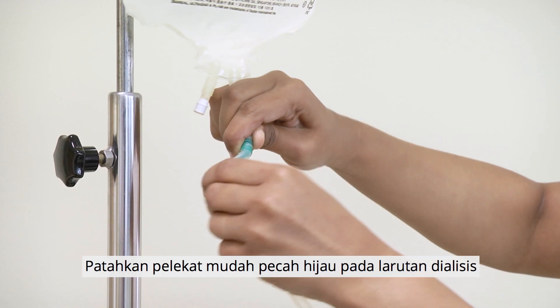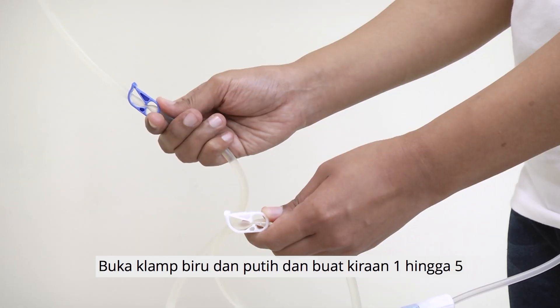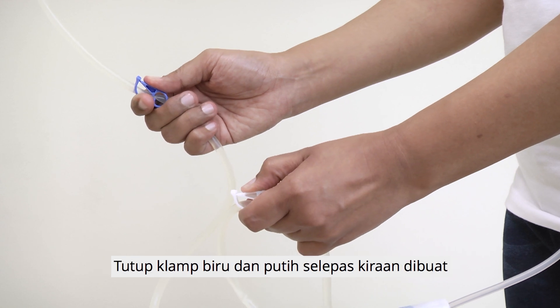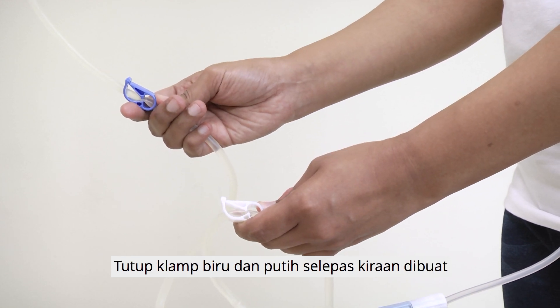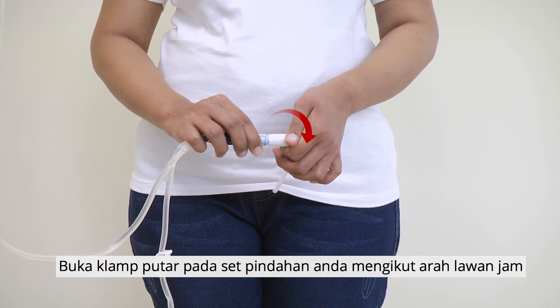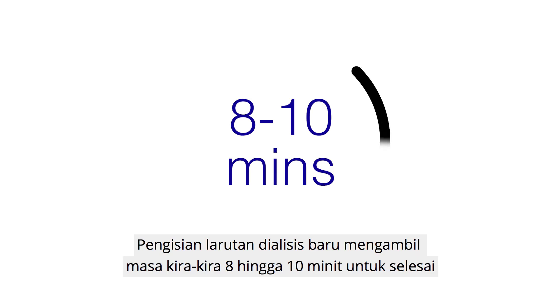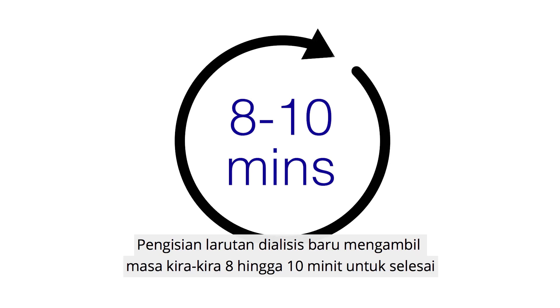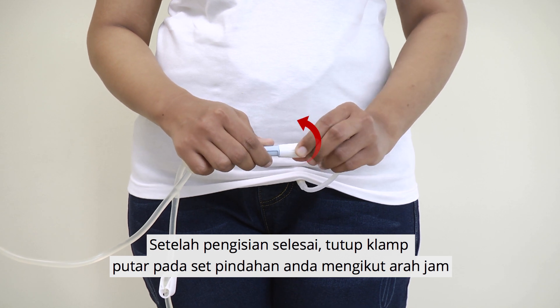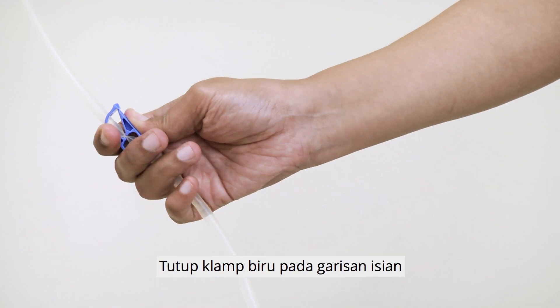Flushing and filling. Break the green frangible seal on the dialysis solution. Open the white and blue clamps and do a count from 1 to 5, then close them after the counting ends. Open the twist clamp on your transfer set in an anti-clockwise direction. Open the blue clamp on the fill line. Once filling is completed, close the twist clamp in a clockwise direction and close the blue clamp on the fill line.